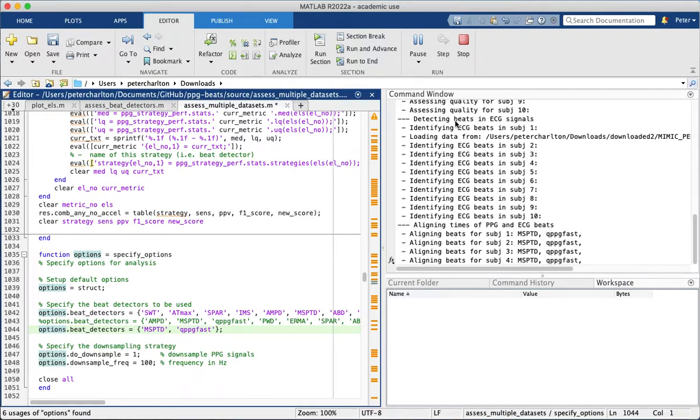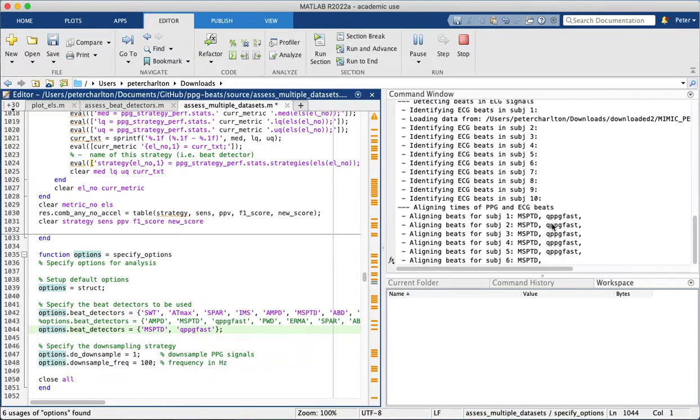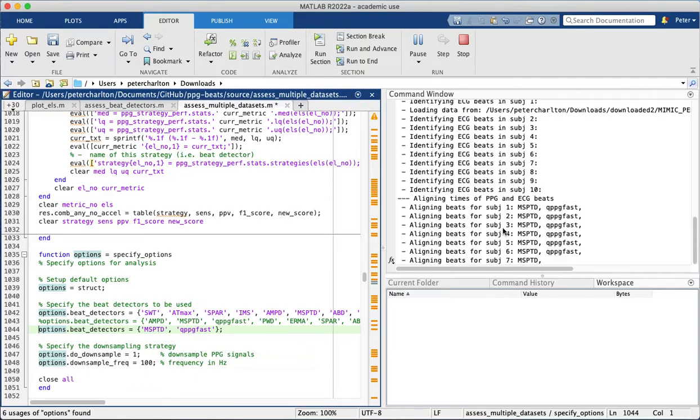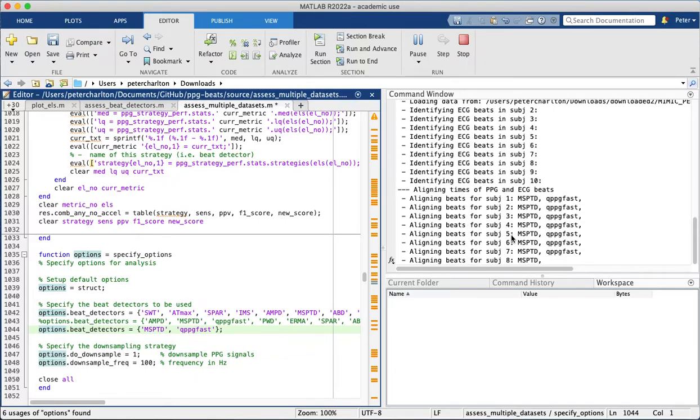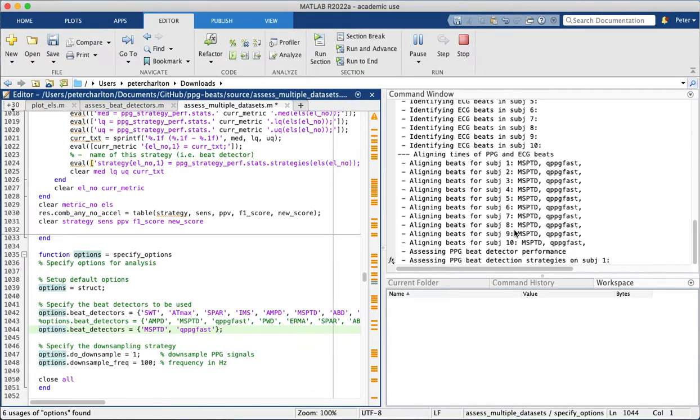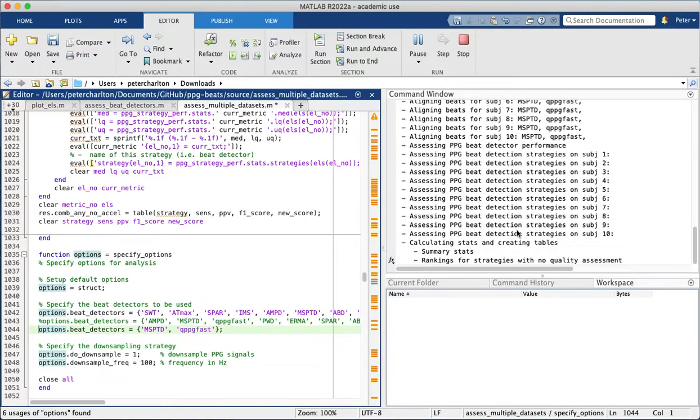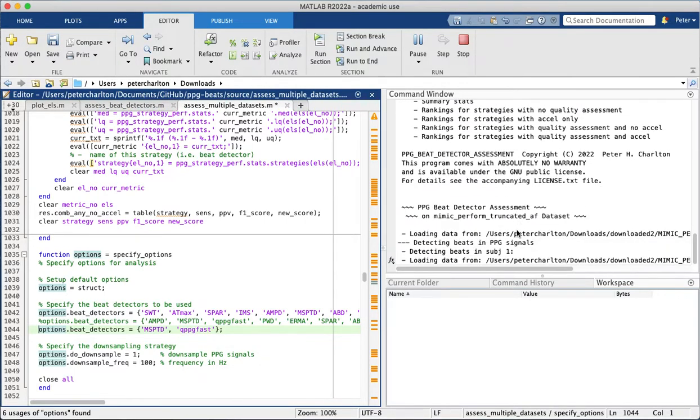It's now identified beats in ECG signals, and those are used as a reference against which to compare the beat detections in the ppg signals. And then it's aligning the times of the ppg and ECG beats ready for analysis. And finally on this dataset, it's assessing the performance of the different beat detectors.